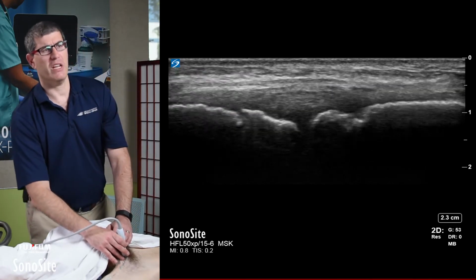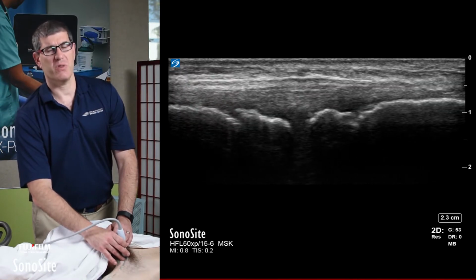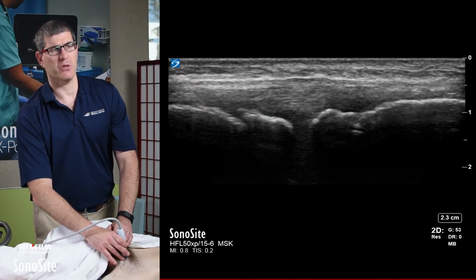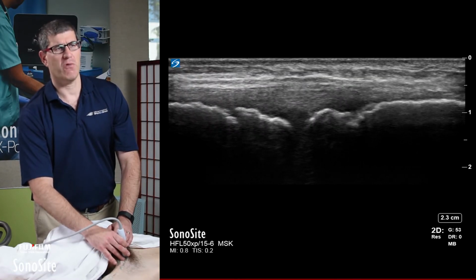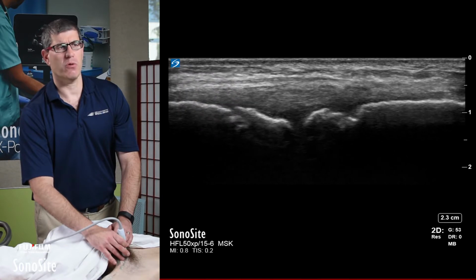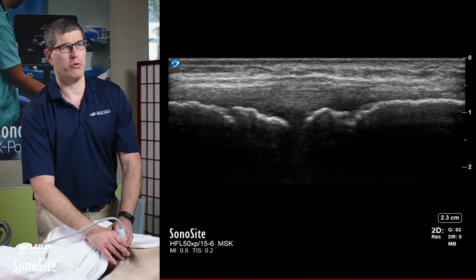One of the things is that in your differential diagnosis, you're going to often have a pubic symphysitis as part of the differential diagnosis. Sometimes you may see some cortical irregularity. This is a relatively young patient, so the cortical irregularity that we see here may be related to some of the cartilaginous growth plate in the region.